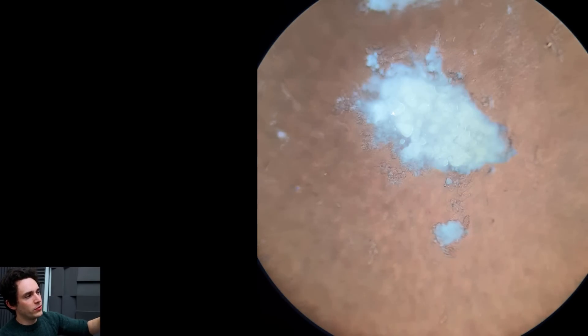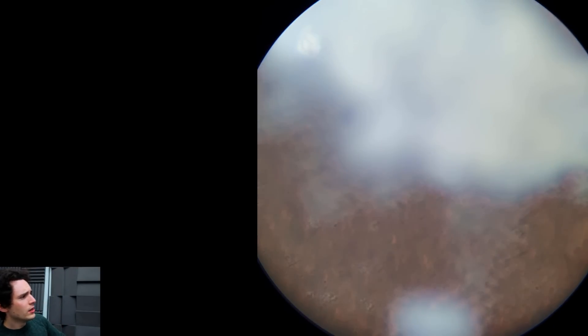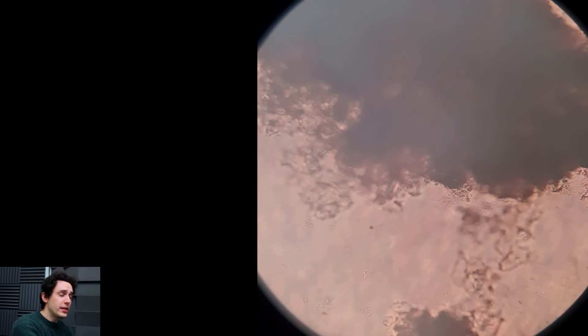So there we go — this is just sped-up footage. I just rinsed the slide clean with water so we could see everything a bit clearer. But that was a very interesting case. I hope you found that interesting.